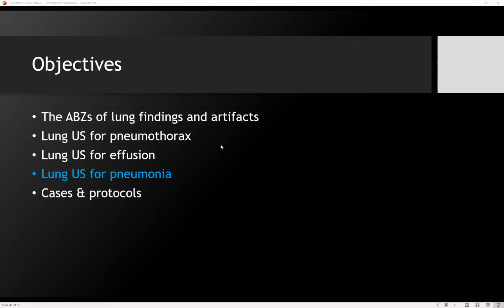I was also just going to say, with ultrasound, if you're having trouble with contrast, especially when you're looking at pleural effusions and other structures, there is a button that's basically an auto contrast that maximizes the contrast between isoechoic things and hypo- and hyperechoic things. So sometimes that might help you if you feel like you're having a little bit of difficulty seeing differences or having good resolution. Oh, thank you. I'll find you to find out where that button is.